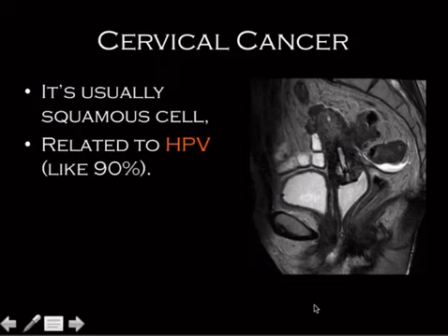If you happen to be asked, this is a Smit sleeve. You may have seen this at the view box. It's a therapy tool. Often they'll jam that thing in there. It's not uncommon to see it. It's not a tampon or something like that.